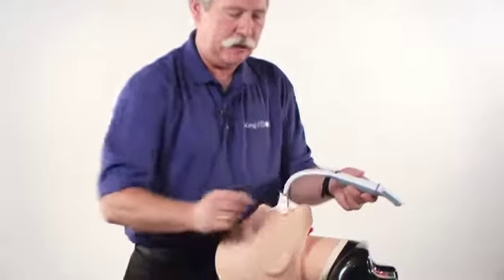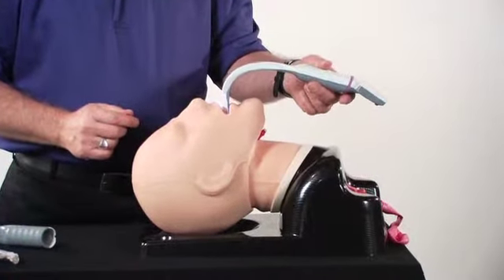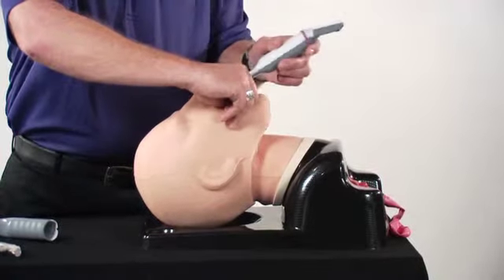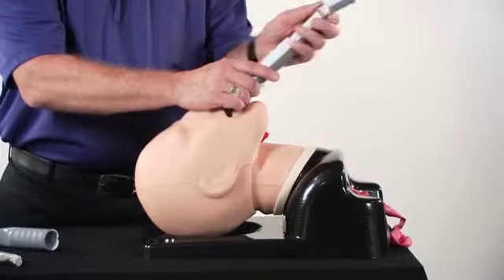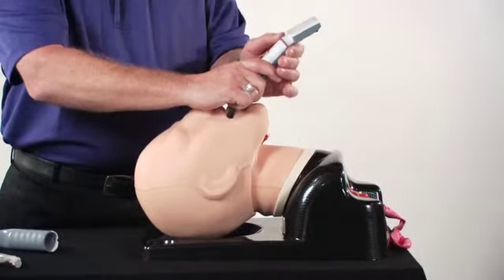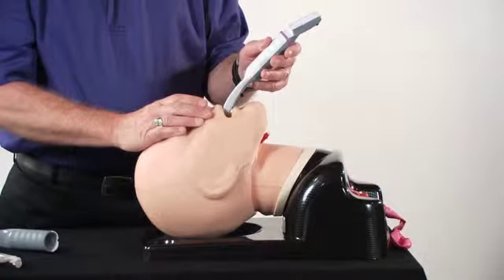In introducing the KingVision video laryngoscope blade into the mouth, there is sometimes difficulty with someone with a large chest, in that the screen may contact the chest. So there's several things you can do. Obviously, if you can open the mouth a little bit wider, follow the base of the tongue, you can also rotate in from the side, or in extreme situations, you can actually introduce the blade first, then attach the display before powering up and visualizing the vocal cords.